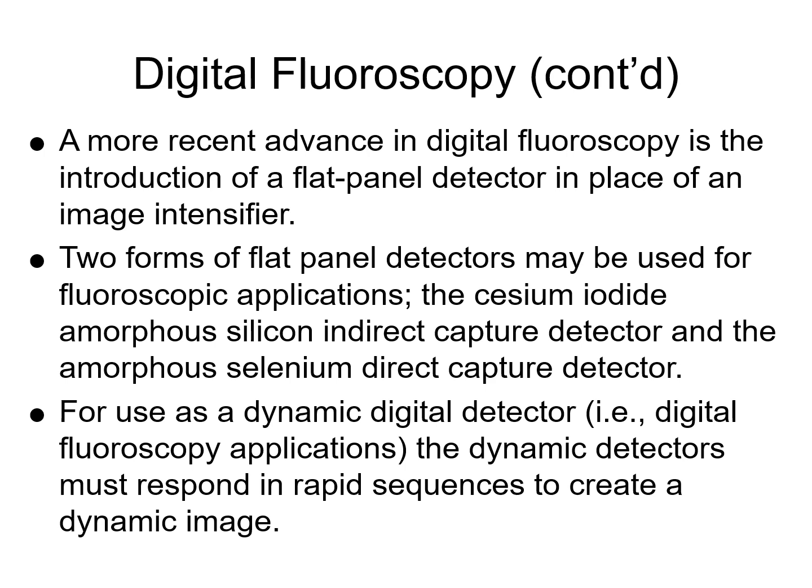Now the other way we have made an improvement, which is completely different than a CCD, is we've swapped out the silicon for selenium. Selenium does not get stimulated by light, it gets stimulated directly by X-ray. And so we've skipped a step, basically. The CCD relies on a light signal to create stored positive charges, which are mapped as pixel intensities.